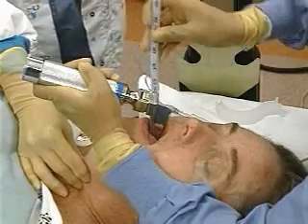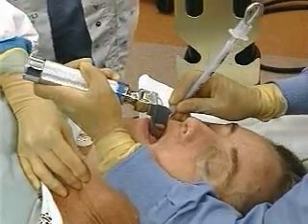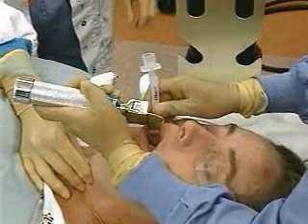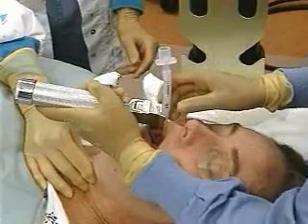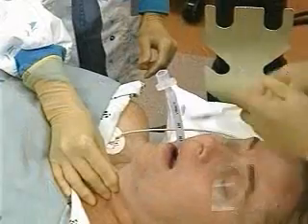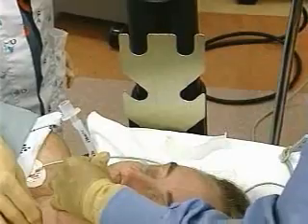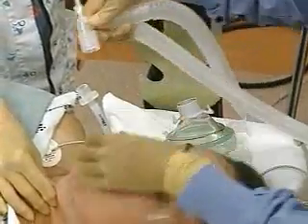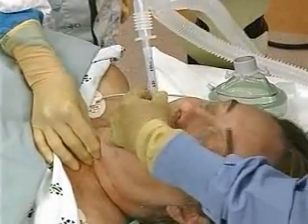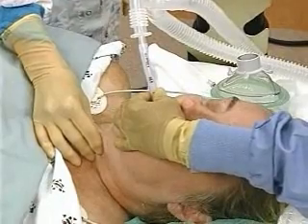Pass the styleted tube with the cuff deflated into the right side of the mouth and through the vocal cords. Remove the stylet as the cuff passes through the vocal cords, then place the endotracheal tube so that the cuff is just distal to the cords and cannot be seen between or above the cords. Inflate the balloon with 5 to 10 milliliters of air and hold the tube firmly in place at the lips. Now place an end-tidal CO2 monitor in the breathing circuit between the tube adapter and the ventilator bag, and gently give several breaths while watching the chest for expansion.